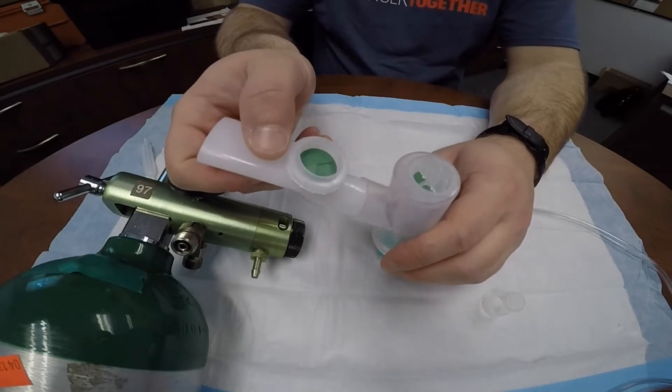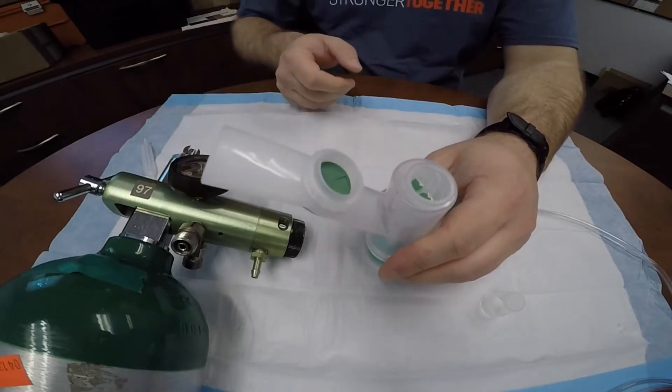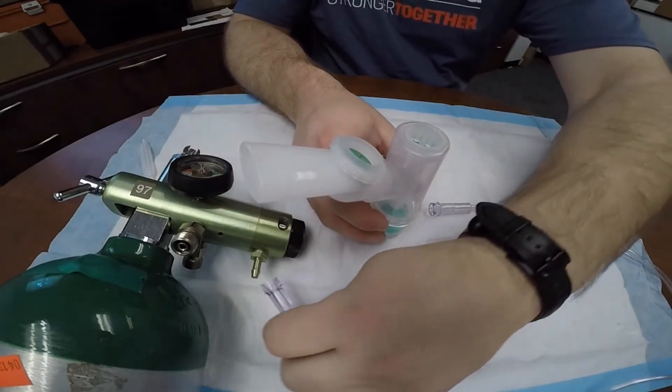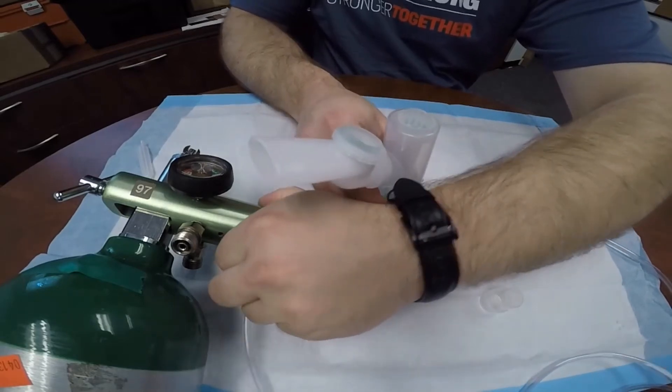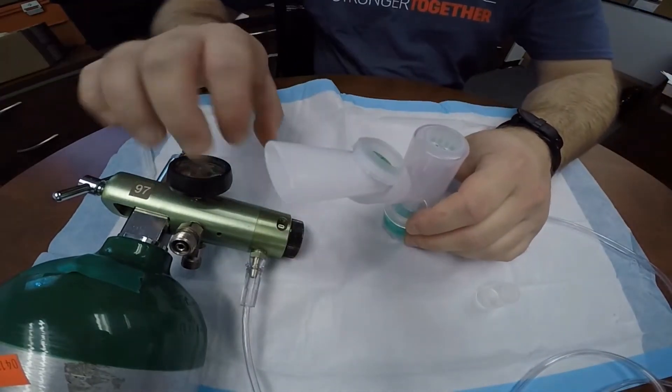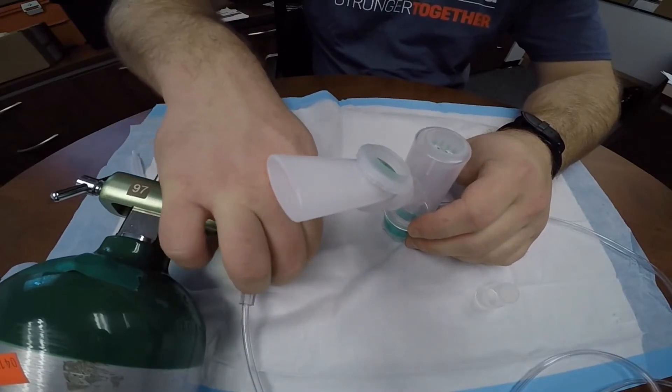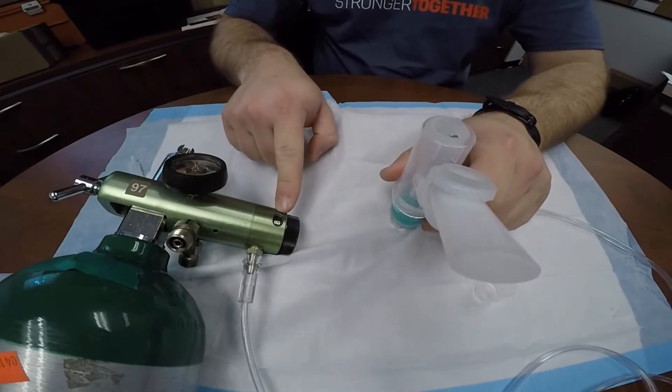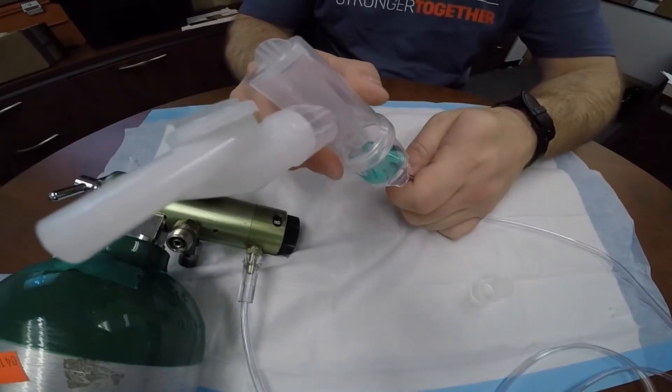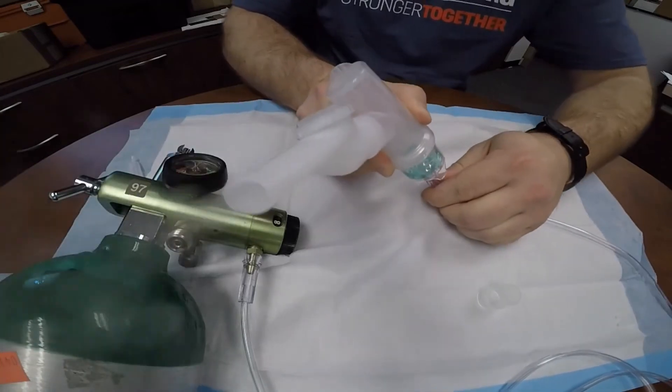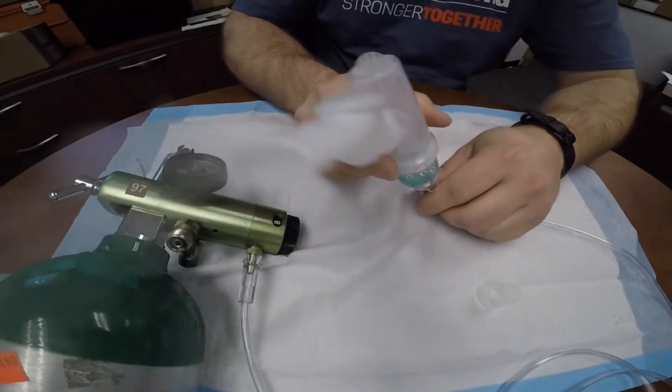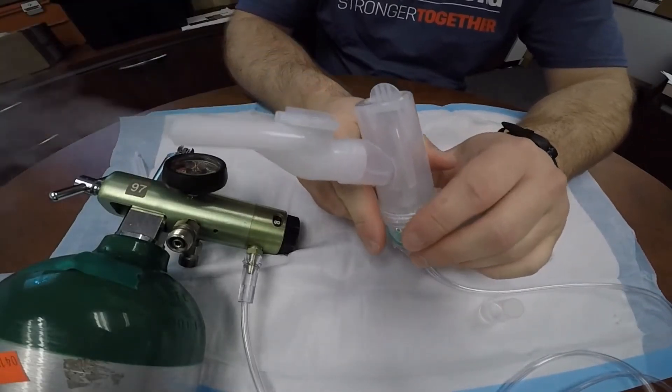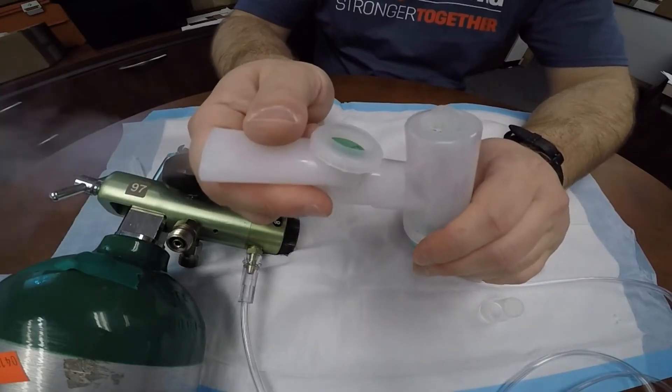Screw the nebulizing chamber assembly back onto it. And for handheld administration, you'll connect the mouthpiece to the mouthpiece port on the side of the device. Connect one end of the supply tubing to oxygen. The manufacturer recommends an 8 liter per minute flow rate. That's 8 liter per minute flow rate. The other end of the supply tubing goes to the oxygen port at the bottom of the nebulizing chamber, and so we have nebulization happening.